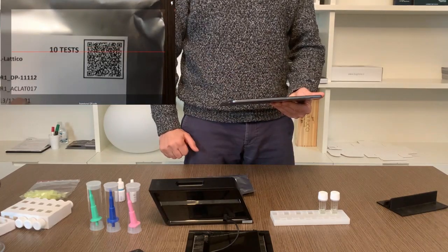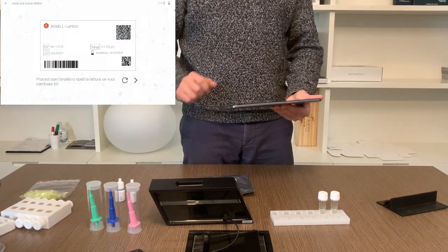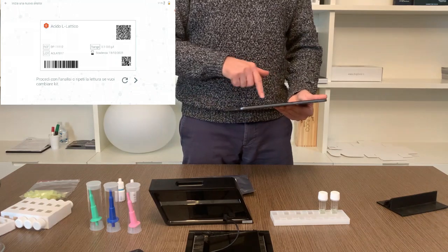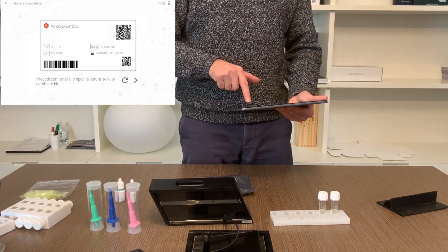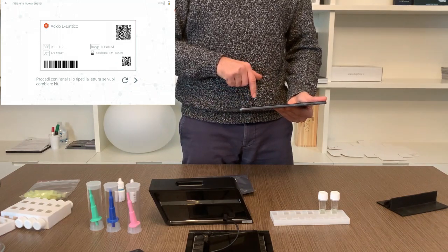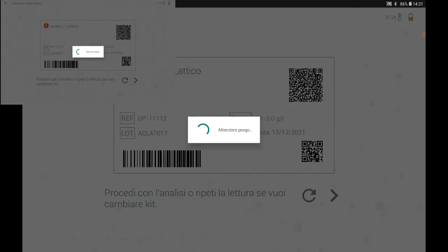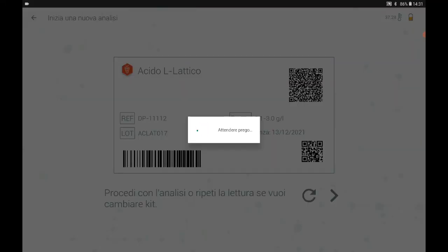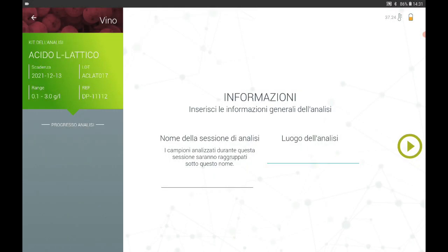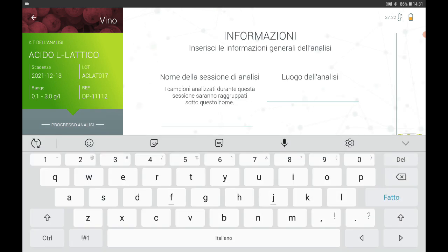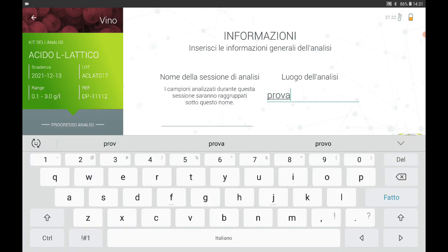Once the analysis procedure is started it is necessary to follow the screens proposed by the app step by step. On the first step you can enter important information related to the analysis you are performing. This information is not mandatory but you can add it at your discretion.